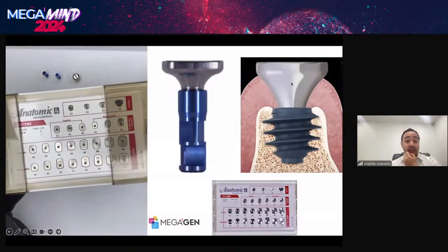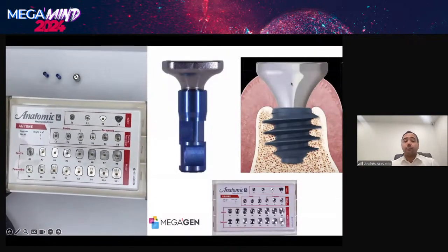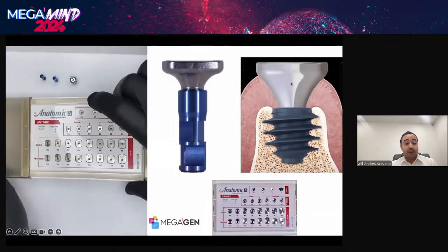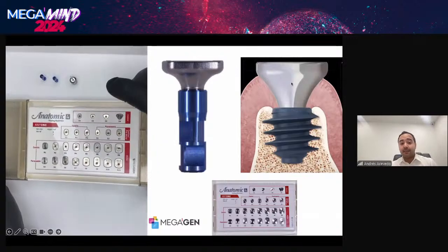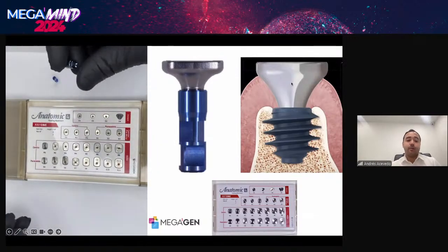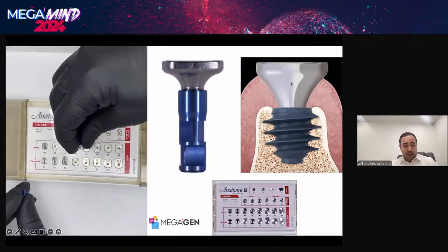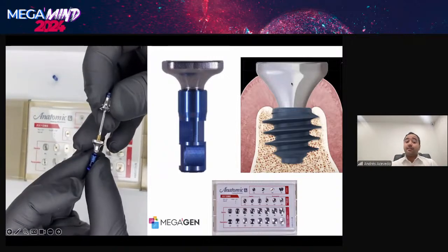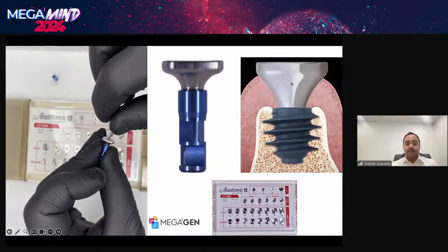Currently, on the market, there are anatomical healing options that simplify the management of the profile, adapting to different clinical situations, respecting that shape and those measurements that Gomez-Meda talks about in the article.